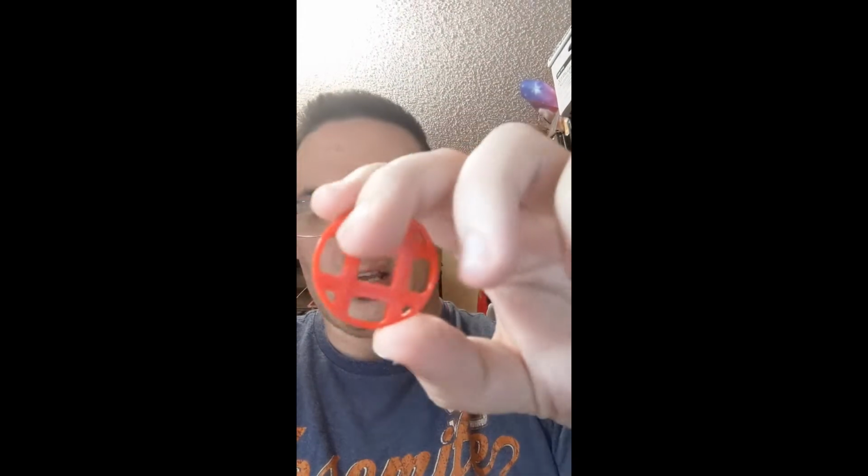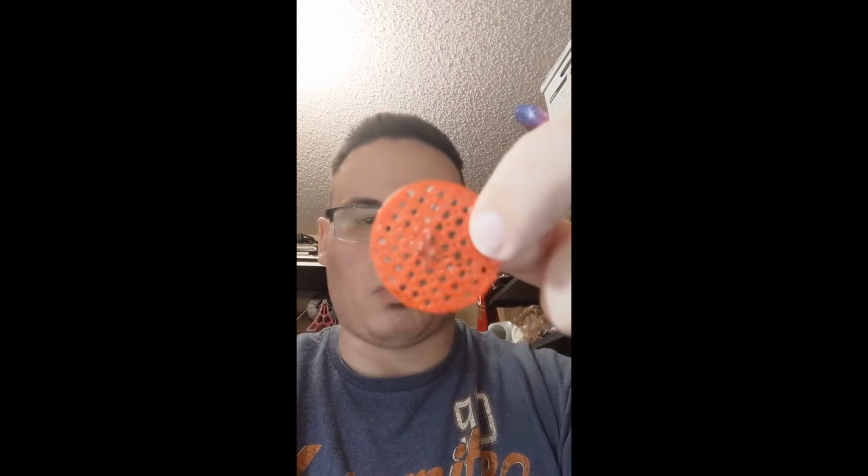So I did that, and also I made a grid to insert inside, because their original one was a waffle pattern like this. If you have something like a LulzBot or one of the other printers that does more industrial printing with a bigger nozzle, this is hard to print. So I redesigned this in Tinkercad.